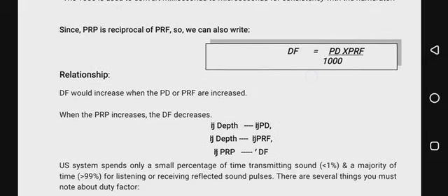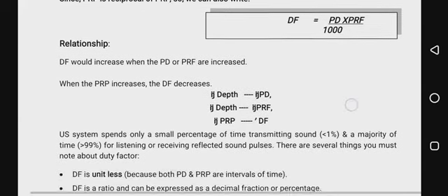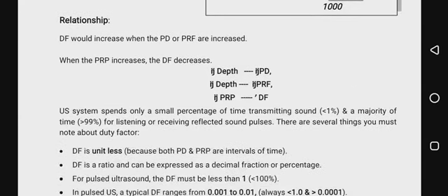So the relationship: duty factor would increase when PD or PRF are increased. When PRP increases, duty factor decreases. Ultrasound systems spend only a small percentage of time transmitting sound.